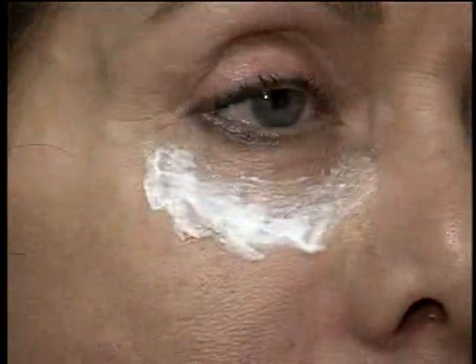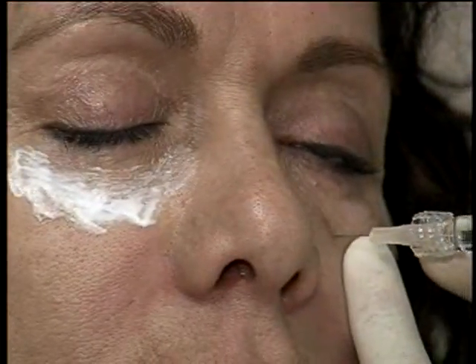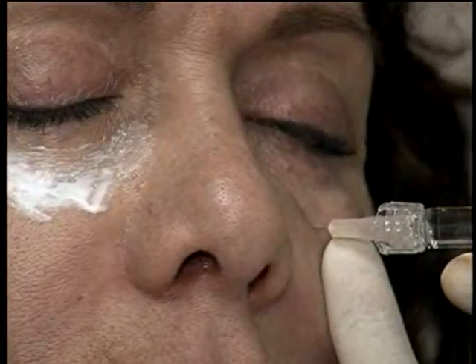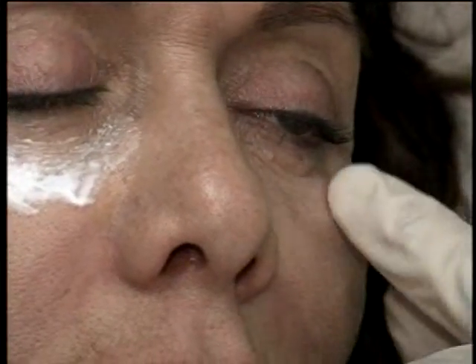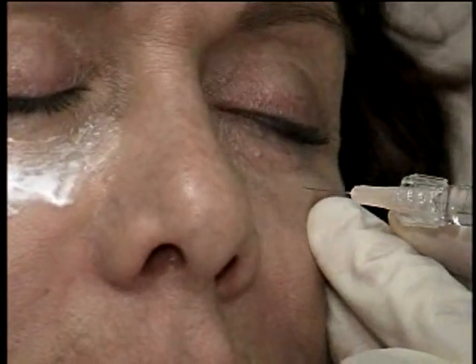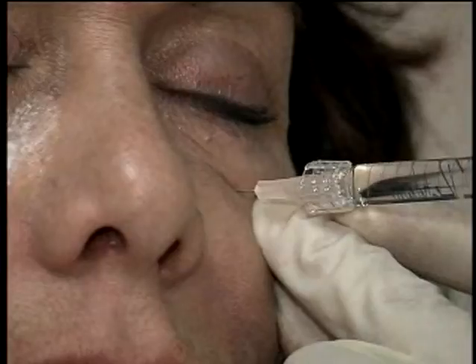Turn your head this way. So frequently I'm like this. I know it's difficult for you to see, so get down to the bone, deposit just a little bit. I'm massaging it as I move along. I'm just marching along the rim.